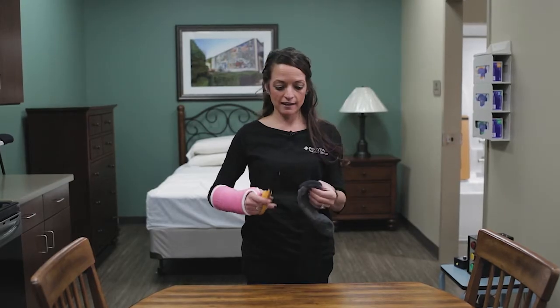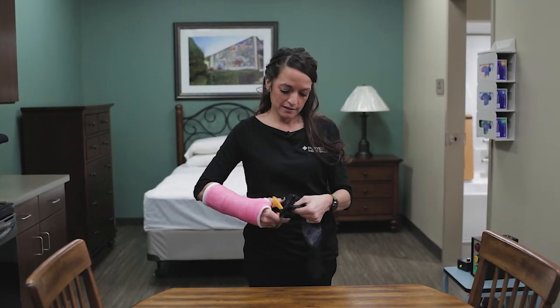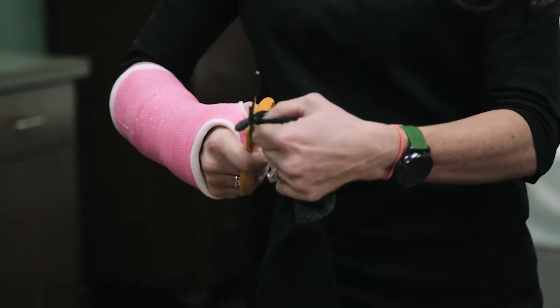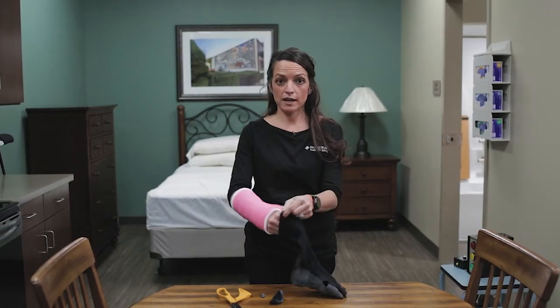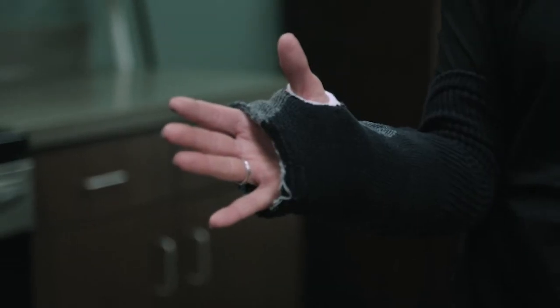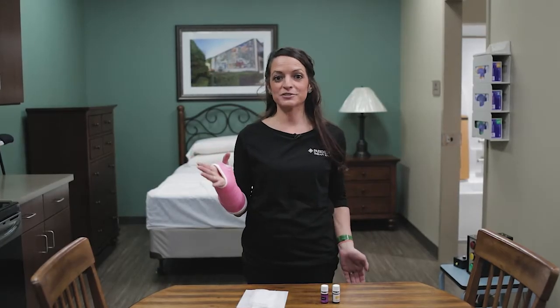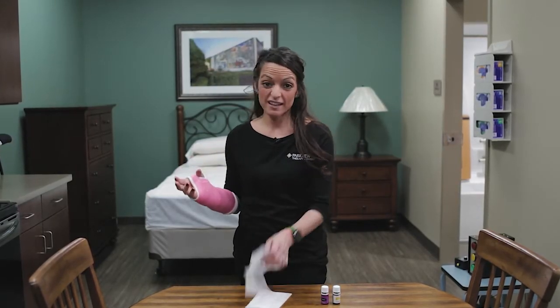You can take an old sock, cut it at the top for your fingers, and then cut a small hole for your thumb. This is nice for when you might go play a sport or be out in the garden — you can put this sock over the cast to help keep it clean.